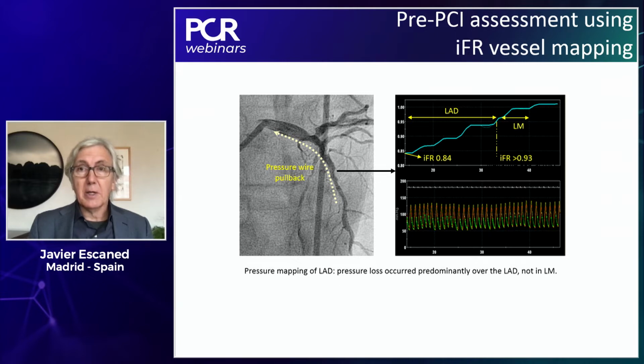And the second thing is to make sure that once you have delivered the bolus of adenosine, the guiding catheter goes back, so it is not engaged into the left main. I think that would be my recommendation. But certainly, you can use it. Of course, you will not be able to make a hyperemic pullback. For that, you need intravenous adenosine.